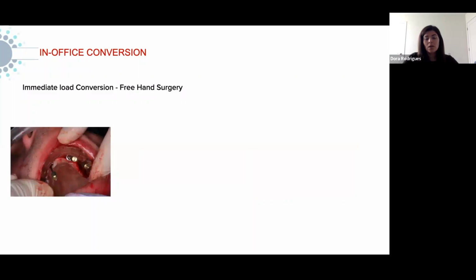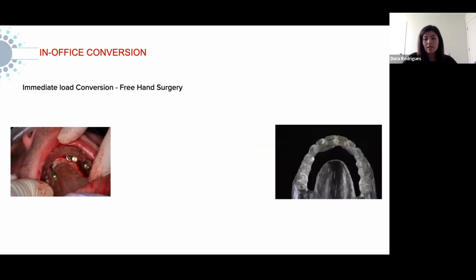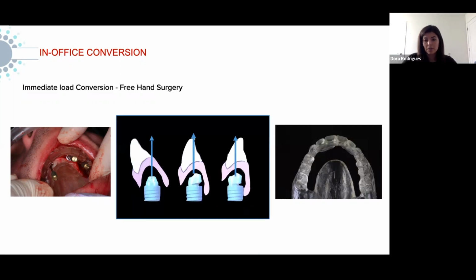and we use the stent again for that, to choose the multi-unit abutments. That's why we have that lingual opening. We want to make sure that for all the abutments, the screw axis is going to be on the lingual. That's how we correct the orientation of the implants, with the multi-unit abutment.